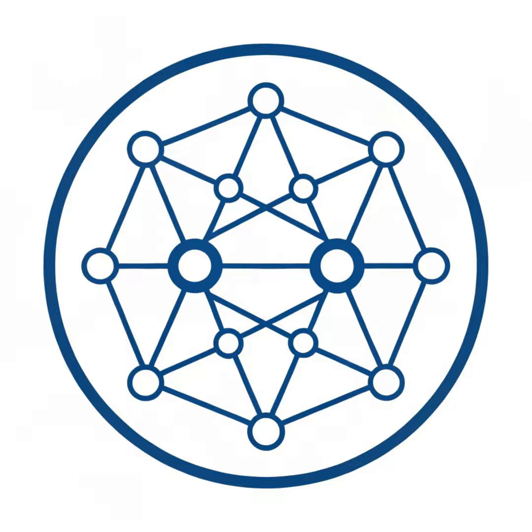Definitely. And then, down at the voxel level, the tiny 3D pixels in the scan, you might get a mix of tissues in one voxel. Partial volume effects. It blurs things. Right, it's just fuzzy. Exactly. And that boundary ambiguity is a major issue, especially near tricky areas like the pleura, the chest wall lining, or the mediastinum, that central chest area. Precisely. Or the central airways, the hilar regions. Tumors there can be hard to define. They might even grow across these lines.